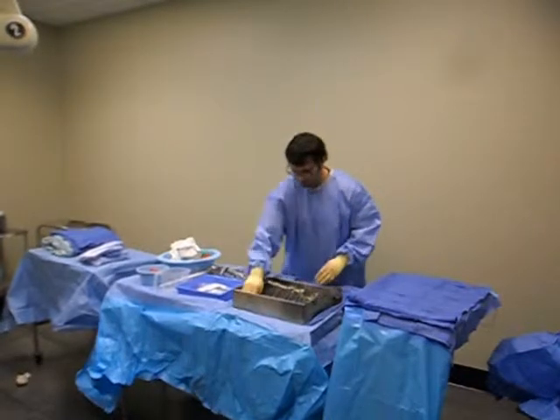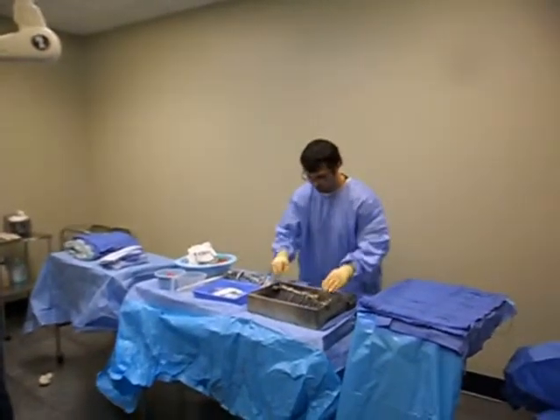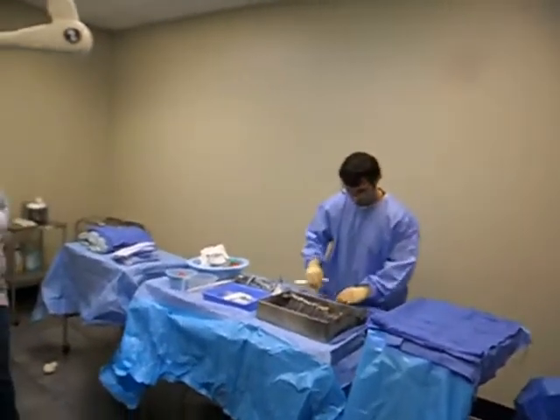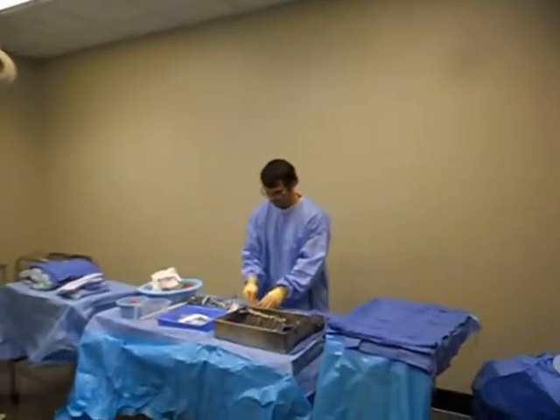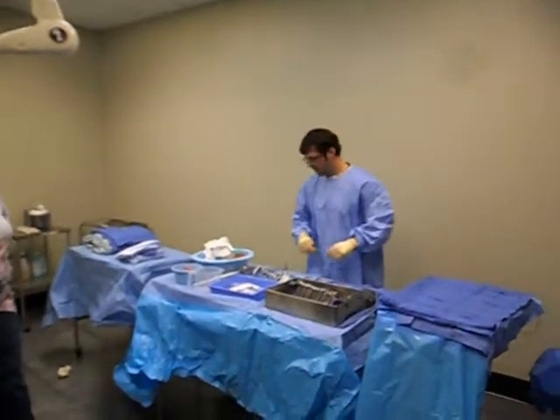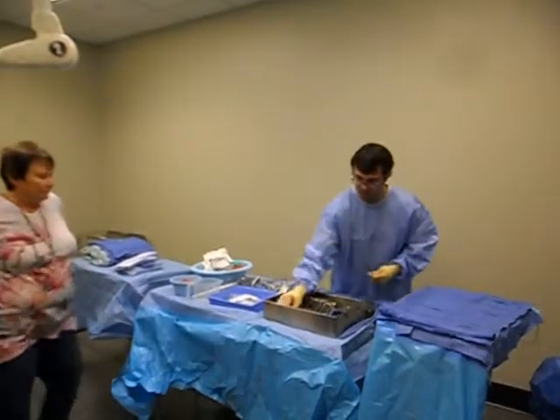Stuff everywhere. Scissors can stay there, this can stay there, and we use that. Okay, you have 10 minutes. Okay, there's a blade on that scalpel. So I suppose at this time, if it's okay with you, I would get count.